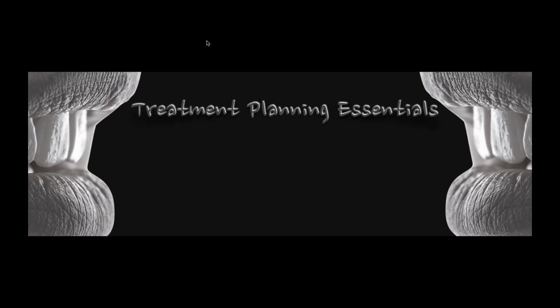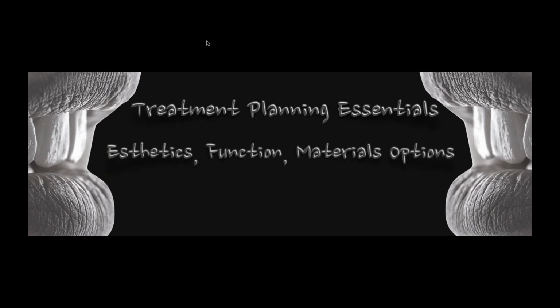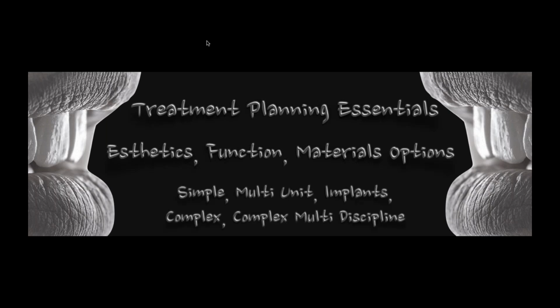Being able to see the jaw move on a video, or looking at wear patterns that you may not have gotten in the impression based on the quadrant model compared to a full arch. So when I'm looking at treatment planning, the things that come to mind right away for everybody are aesthetics, function, and then for us in the laboratory, material options. Which ones do we want to use and where do we want to use them? But I also think there's more to it, right?